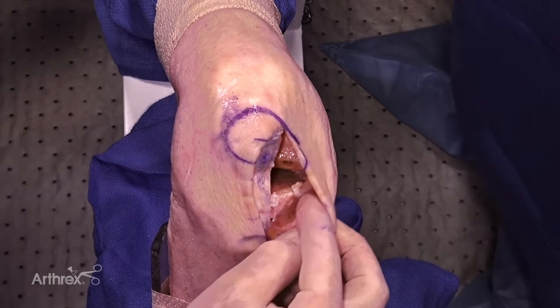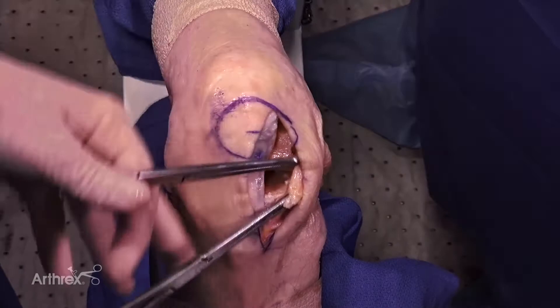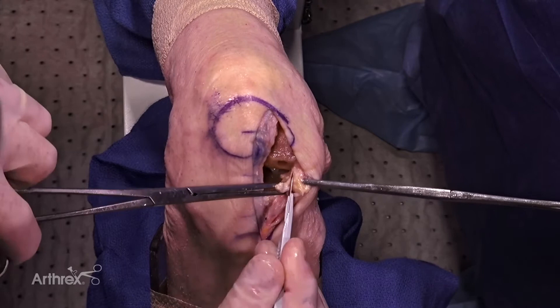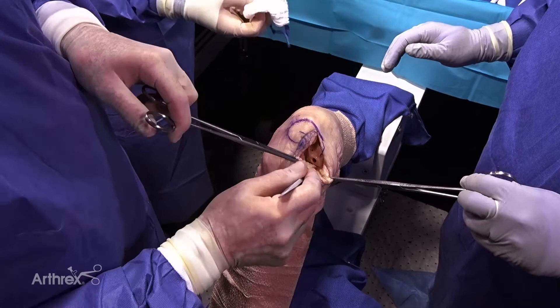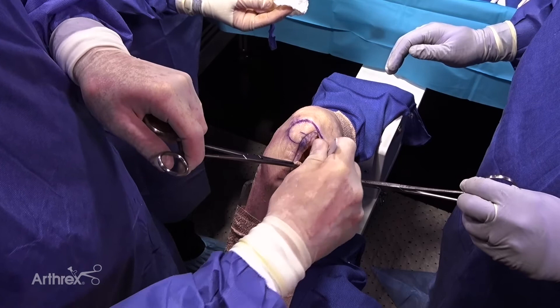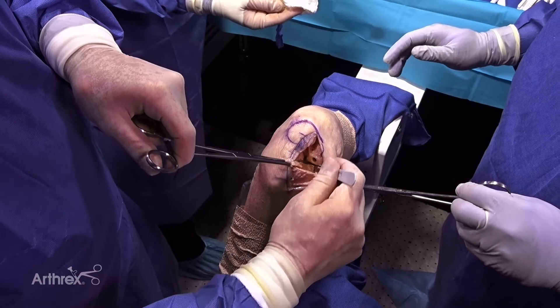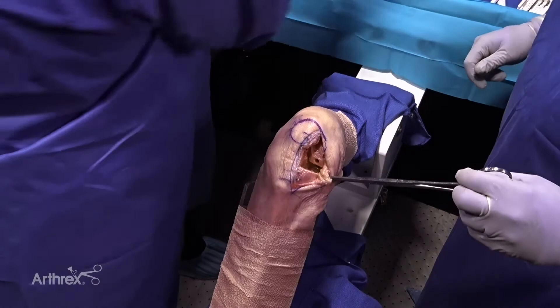One of the things that does impact balance when you're testing is retractors in the knee tensing the MCL, and also the remnant of your medial meniscus. At this point I take the medial meniscus out. It's very, very important to stay on the meniscus, not at its periphery where the MCL can come in and you can damage the MCL. There's also a little bit of redundant posterior capsule when you get right past the MCL that can impinge into the joint, and so I make sure as I'm taking the meniscus out that I remove that. There's our meniscus.